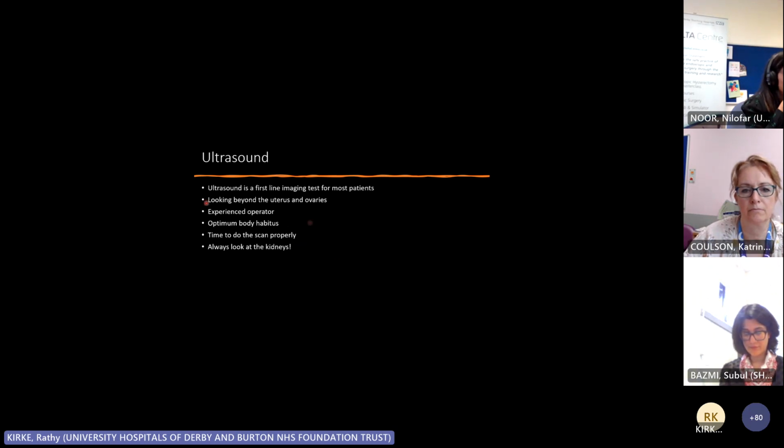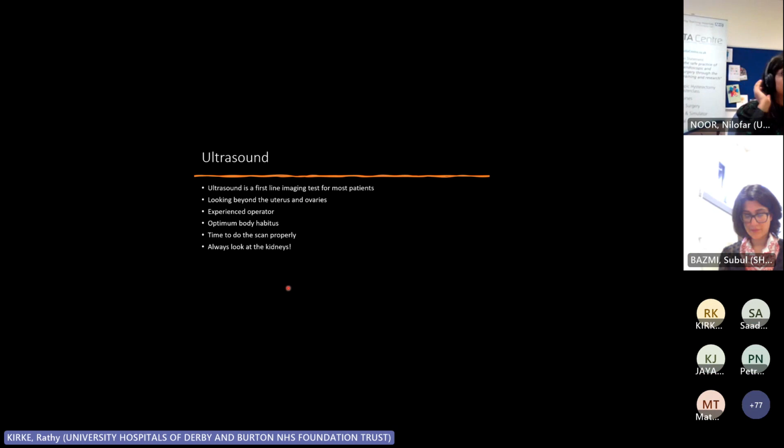So with ultrasound, we look beyond the uterus and the ovaries. It's not just looking at the uterus and ovaries, which is obviously a first step: look at the uterus, look at the ovaries, and then you've got to go beyond those.